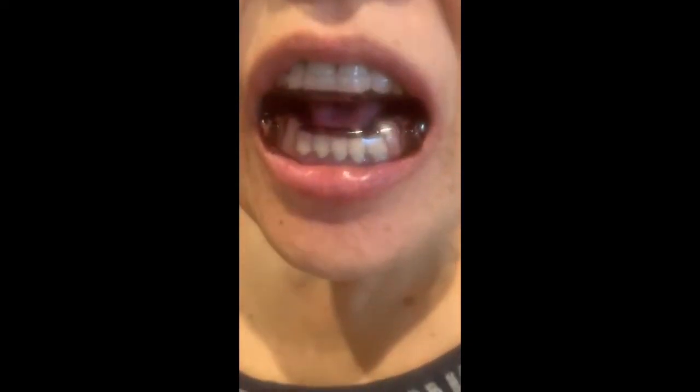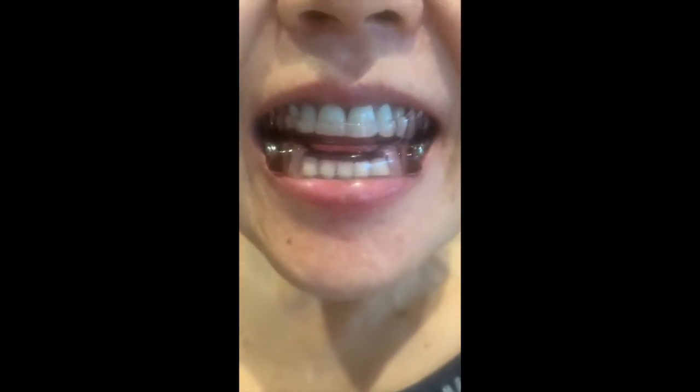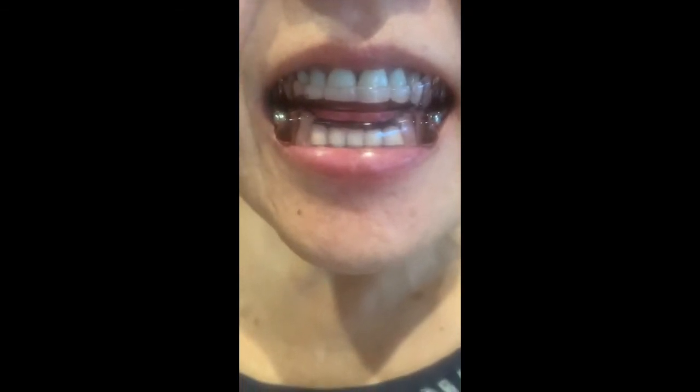Beautiful. Turn a little bit towards me, beautiful. Close your teeth together, smile real hard. Look where that tongue is — that's perfect. Notice how the tongue is popping out there. Good, great.